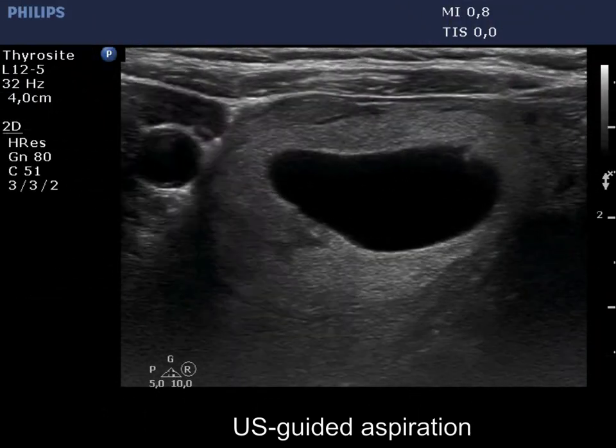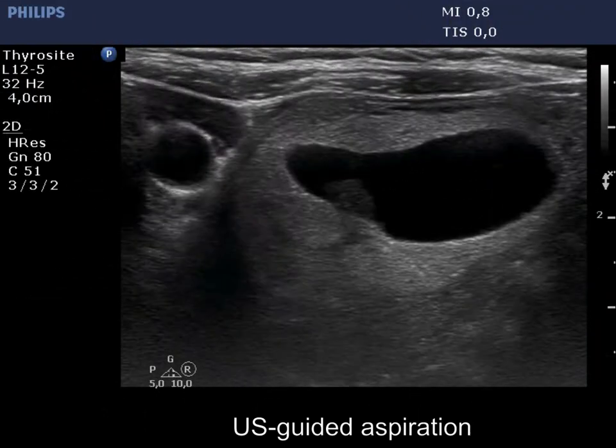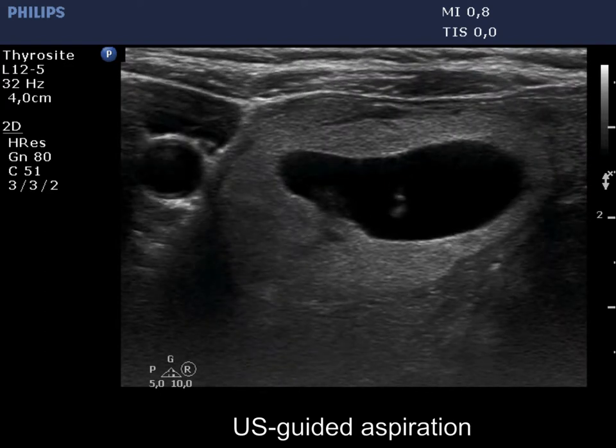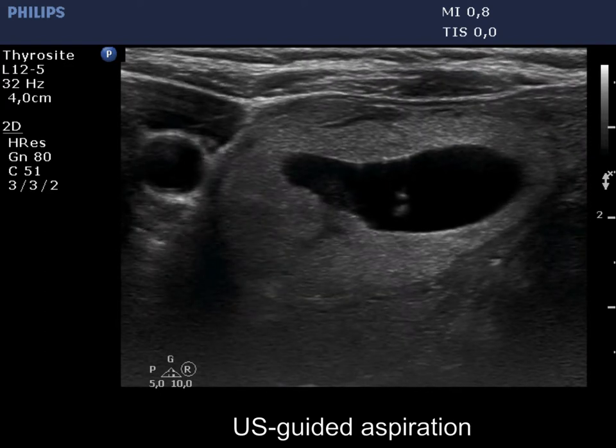Now, we perform ultrasound-guided aspiration and remove 4 mL of serous fluid.